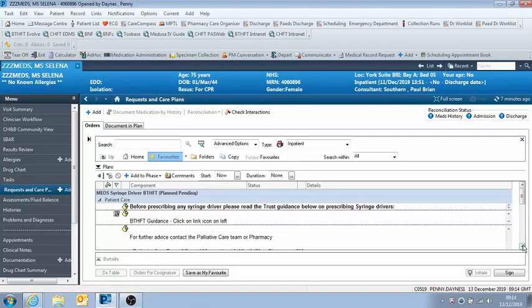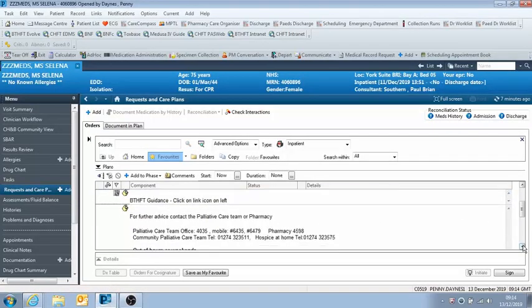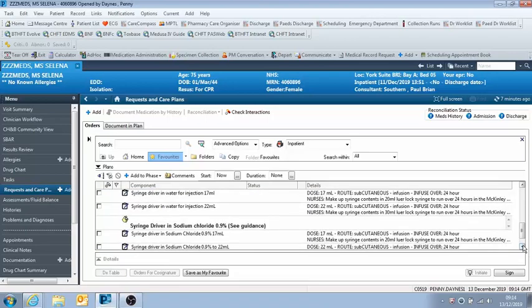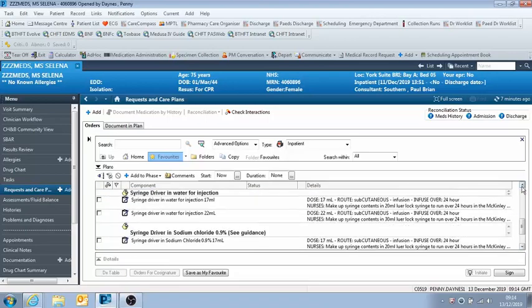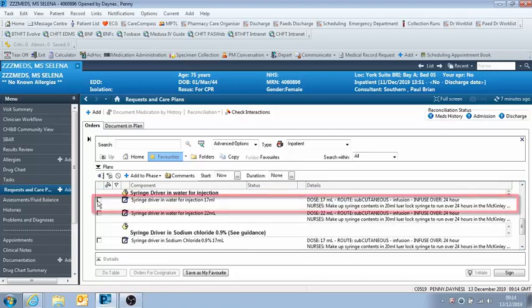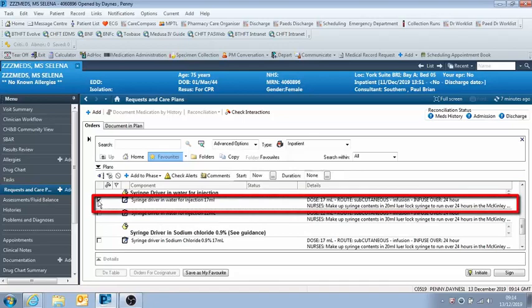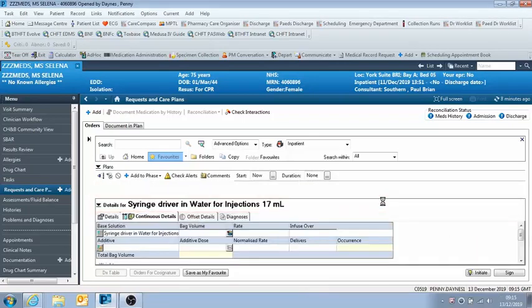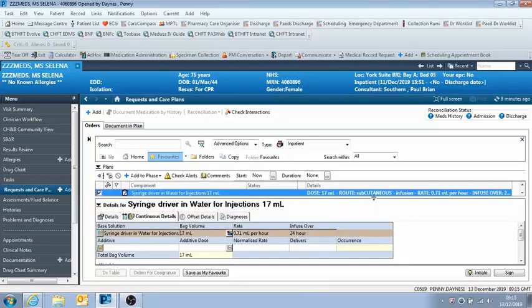Okay, so the one that we want is the syringe driver for water for injection 17 mils, which is just here. And then you just click on the dose fields and that lets you add in your drugs.